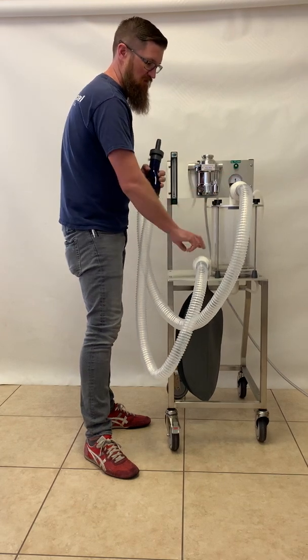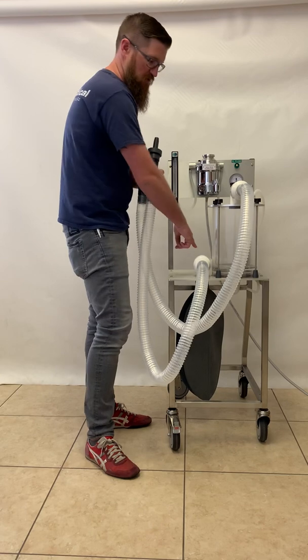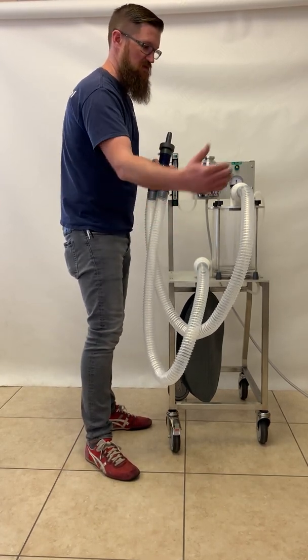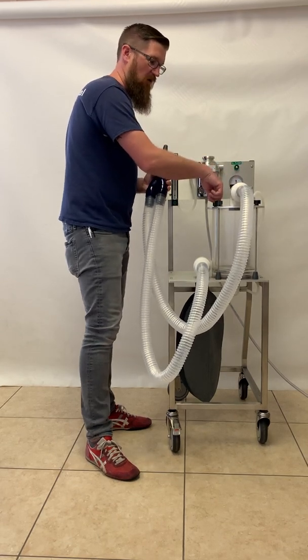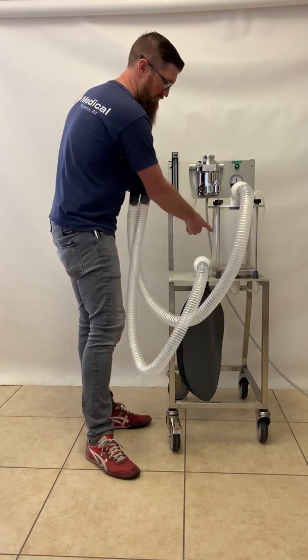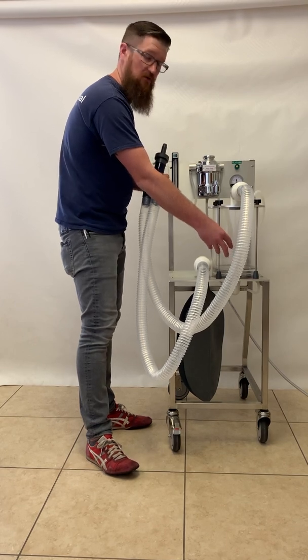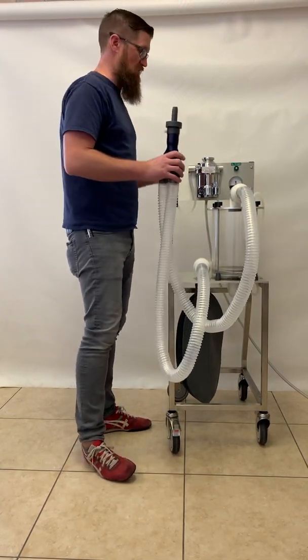The inspiratory and expiratory valves keep the gas moving in the proper direction. This valve will only let the gas go out to the animal, and when they exhale, it will pass through the expiratory valve into the absorber. The absorber pulls out the CO2, and then the fresh gas gets mixed with the oxygen and isoflurane coming in underneath and goes to the patient, and that completes the circle system.